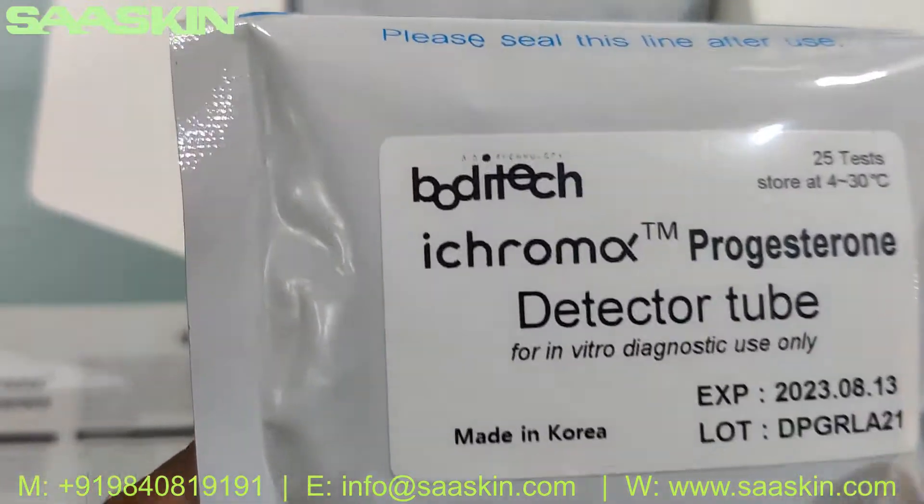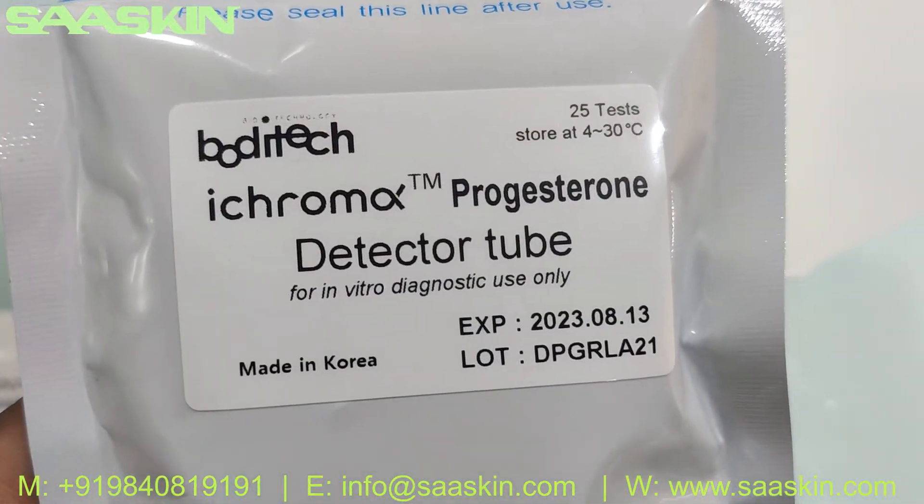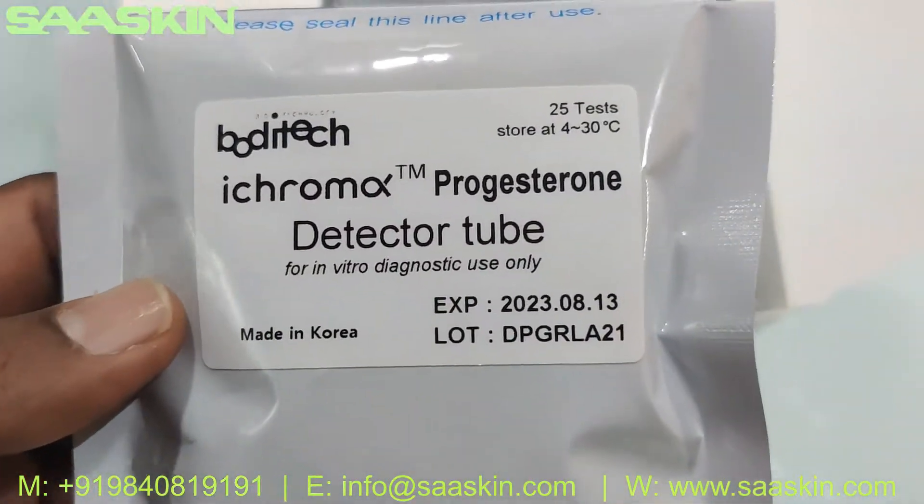You've got a PROGESTERONE detector tube. This is a 25-test kit pack, so you have 25 tubes in this pack.